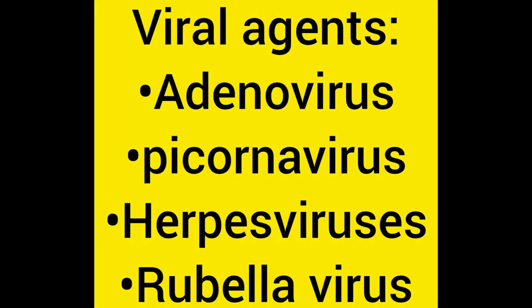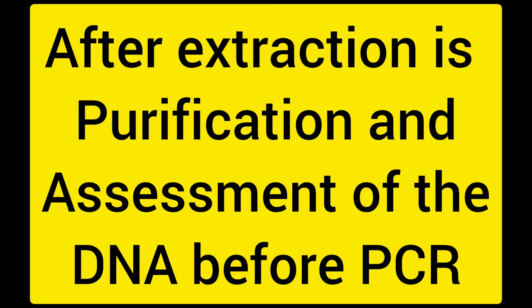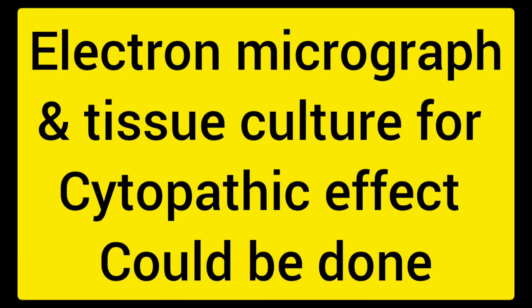Then the viral agents are Adenovirus, Picornavirus, Herpes virus, Rubella virus. Under the herpes, you have Varicella zoster. Then for viruses, you have to extract the DNA, and after the extraction is the purification and assessment of the DNA. We could also do electron microscopy and tissue culture.